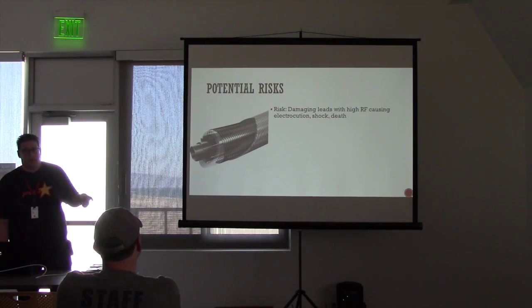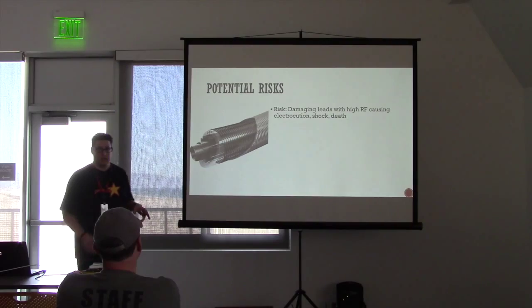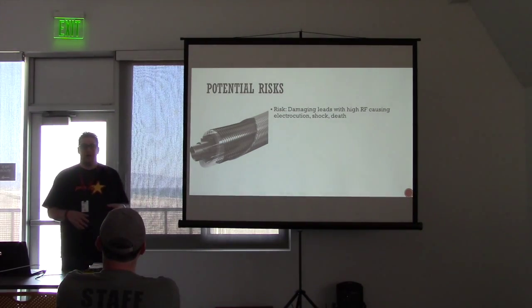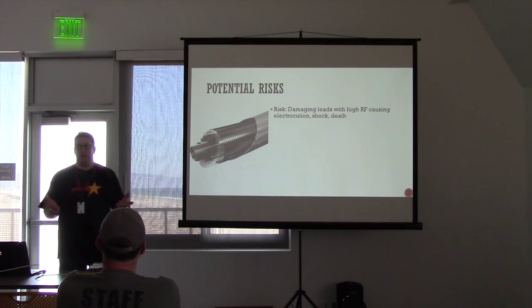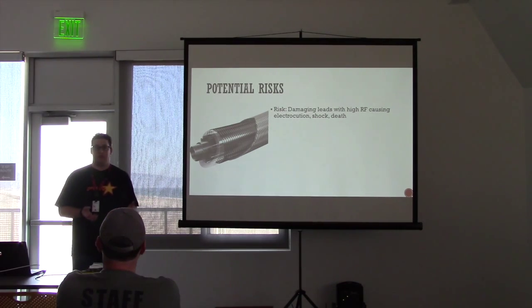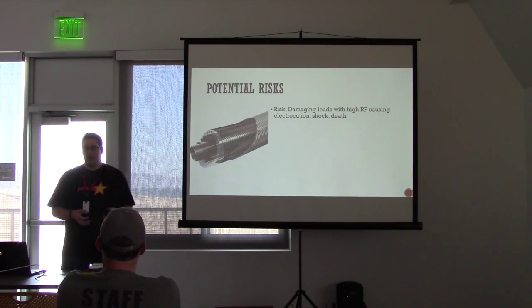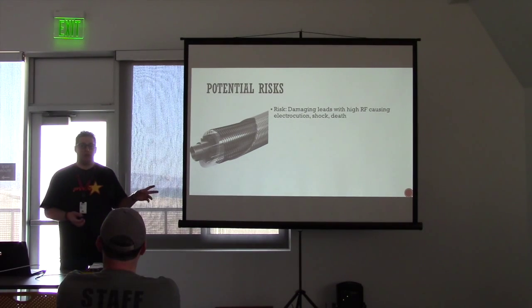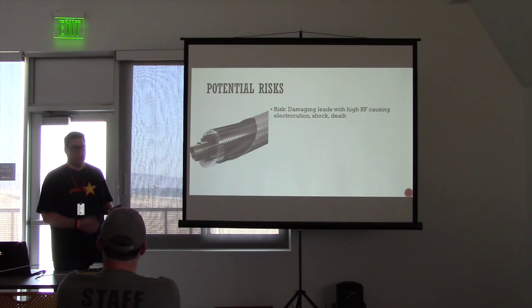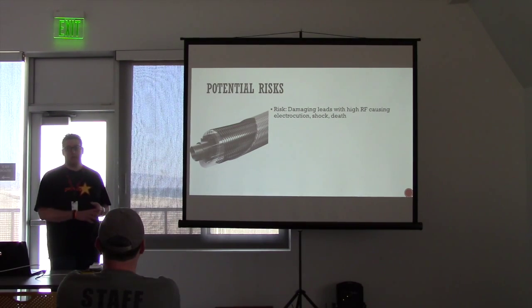This is the one that I was actually most concerned with, because there was a problem with some of these, as I said, that were scarring the back because of RF interference. Well, I work for a company, there's tons of RF in the house. I was more worried about the stacks of routers that I do testing for, and the devices I use for sniffing wireless traffic, causing damage where it would send signals out and may interfere with management profiles. So the latest version of this had RF shielding across the entire cable.